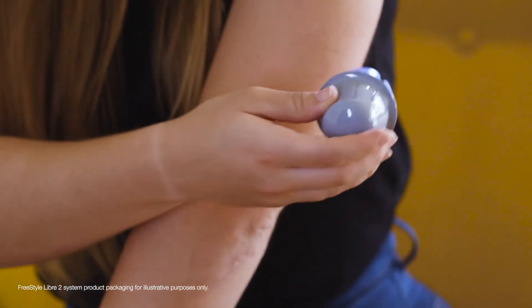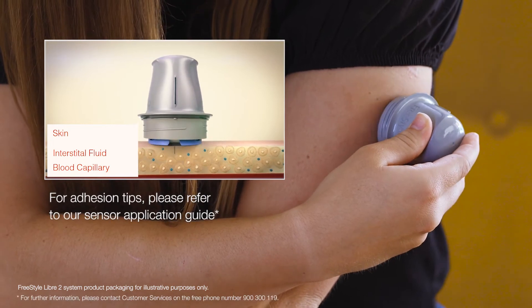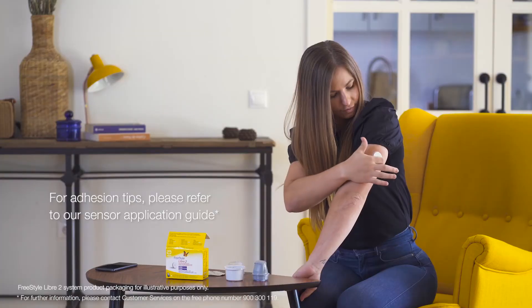Place the applicator on the back of your arm, then press firmly to apply the sensor. Finally, gently remove the applicator and smooth the edges of the sensor to ensure optimal adhesion.